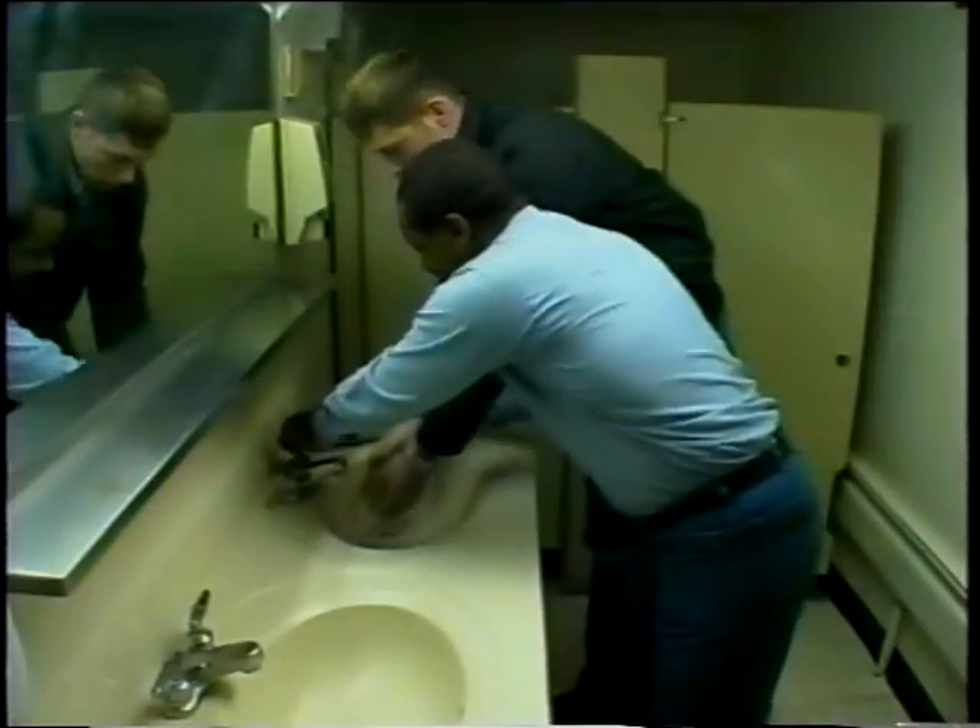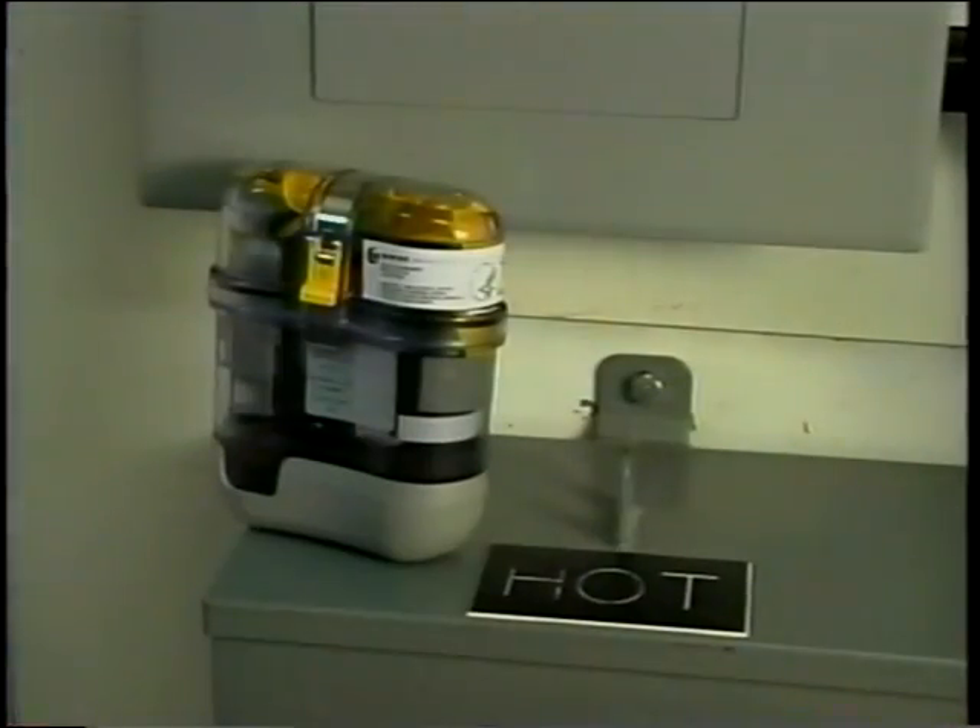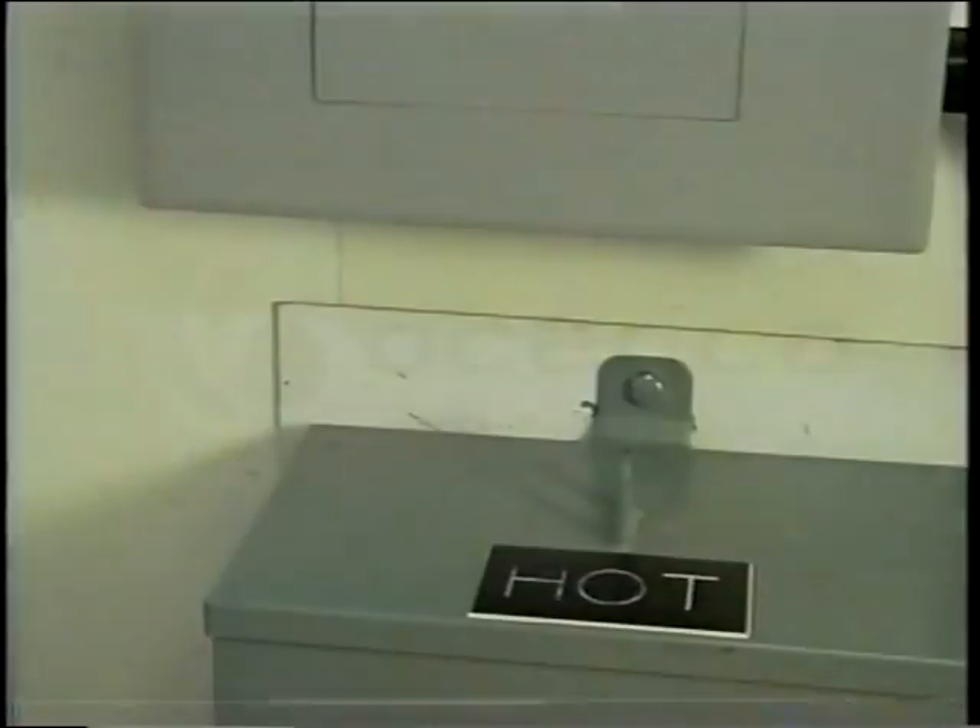Do not immerse the Osinko EEBD in water. Do not place the Osinko EEBD near a heat source greater than 140 degrees Fahrenheit.